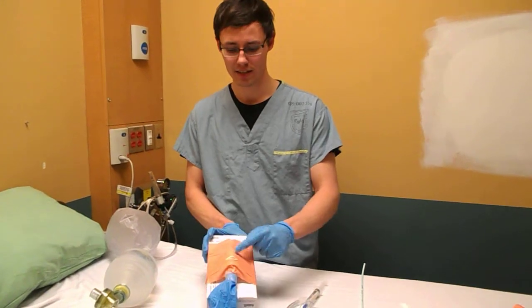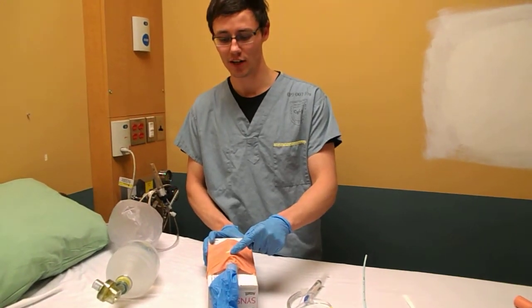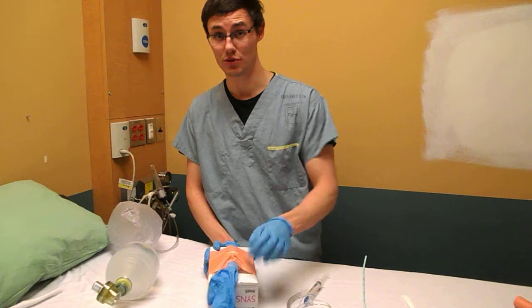Landmarking: thyroid cartilage, cricoid cartilage. This glove is to represent a lung.